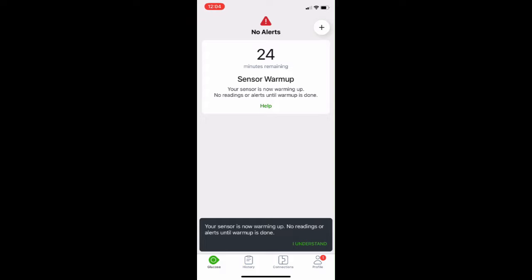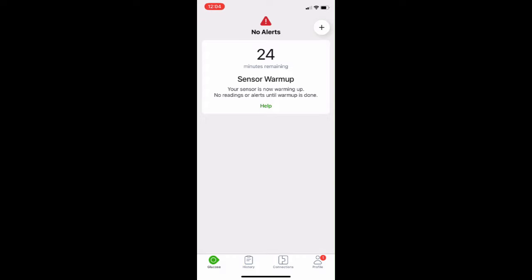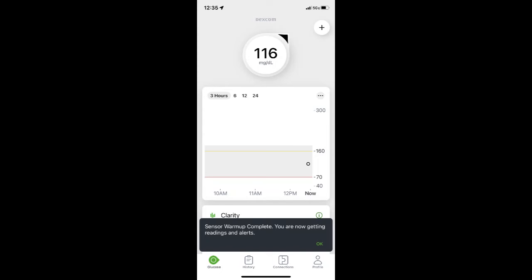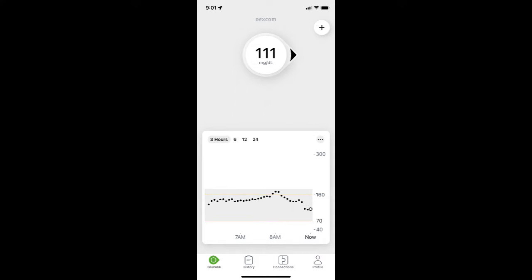The startup period has now started — it's 30 minutes, not 24 hours like the G6. After the 30-minute warm-up, you'll get a notification saying your sensor is ready to send blood sugar readings to your phone or receiver. I only use the app. My first reading is 116, and I'll be getting readings for the next 10 days.